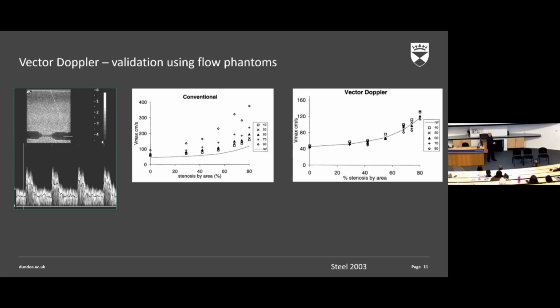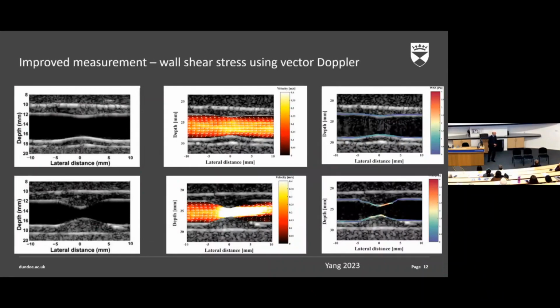So the same experimental setup using our dual beam vector Doppler system. This time, the measurements are quite tightly contained, and they're all around about the right value. So use of this two beam system is vastly increasing the accuracy of the measurement. So that certainly helps.